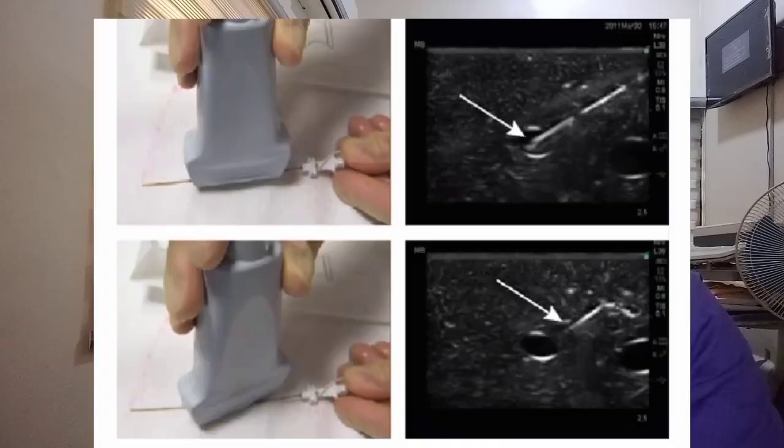Now, the greater the angle of the needle to the beam, the easier to see it. This image shows you how that should be done, and on the right hand side, you see what the needle will look like on ultrasound, and the arrow indicates the echoes coming from the needle.